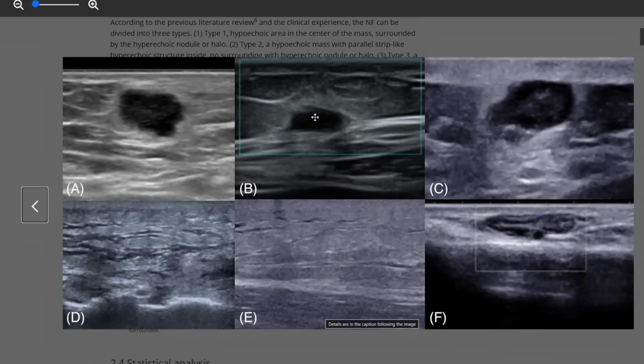Well, because I don't see, at least in the hypoechoic region, that many white tissue structures. I don't see any structure that's reflecting the sound waves back because it's very dark. So I don't see any white in it.